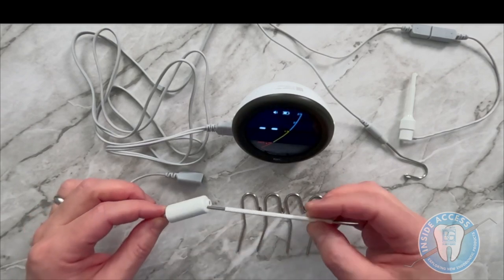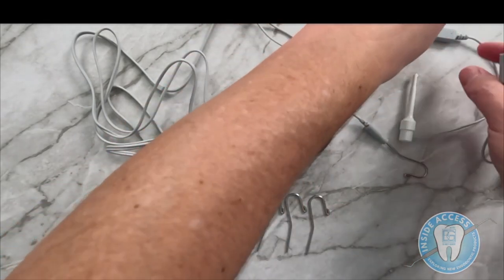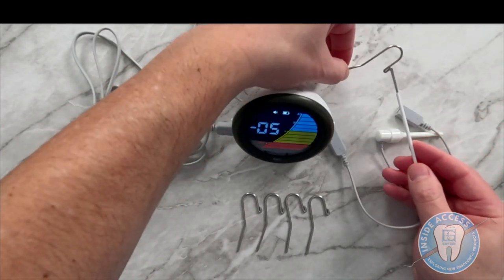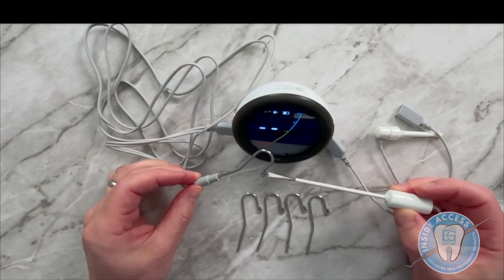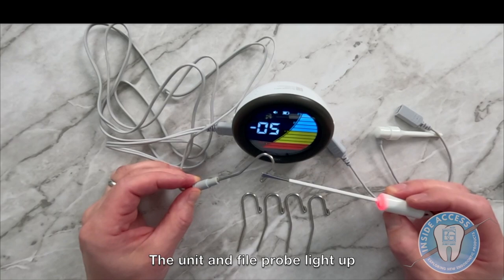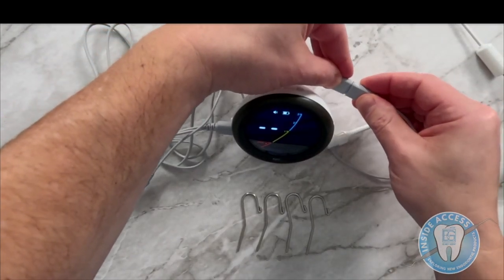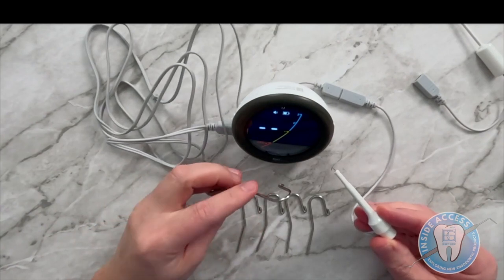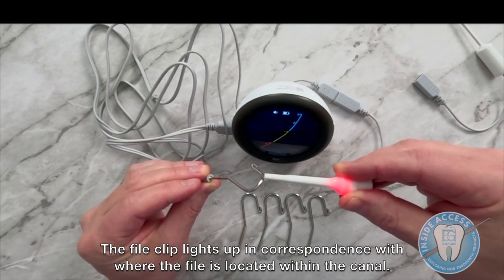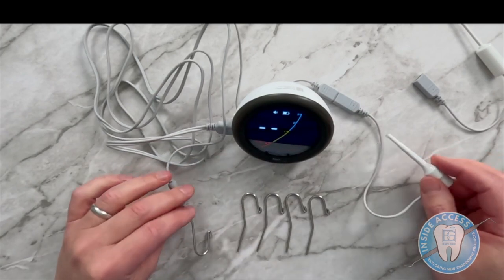The other feature they give you is a probe, which is very helpful. It goes into the little holder and will be used in lieu of the file clip. One of the unique features you'll see on this unit is how it lights up — not only on the unit itself, but also on the file probe and the lip clip. The file clip actually lights up in correspondence with where you are: red means you're out past the apex, yellow means you're right on the money, and blue means you're still more coronal.